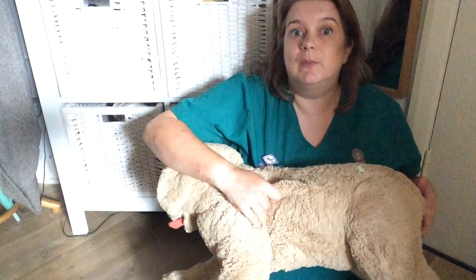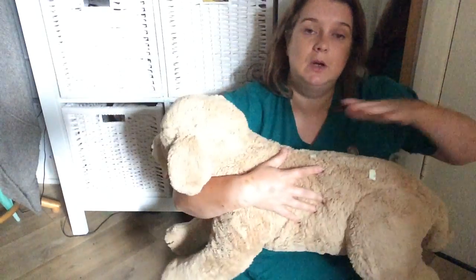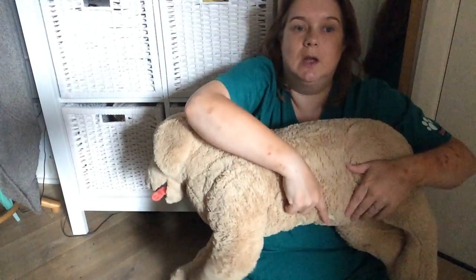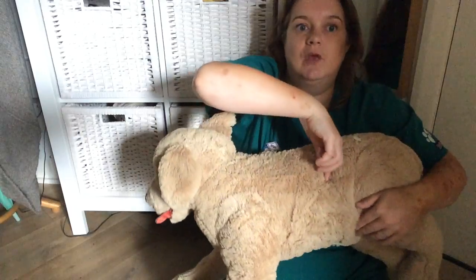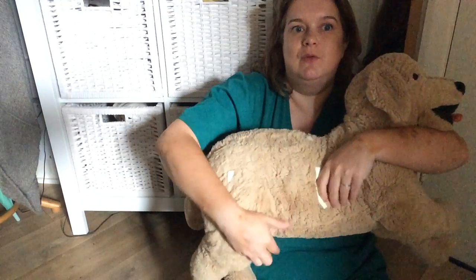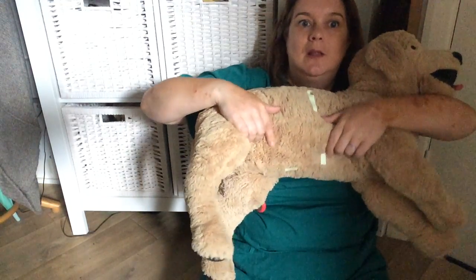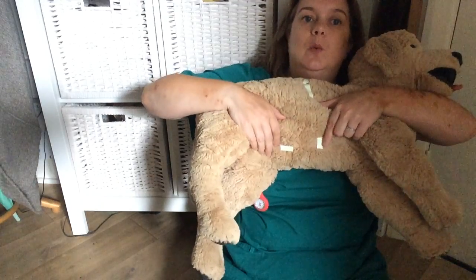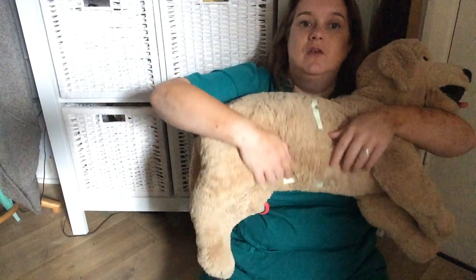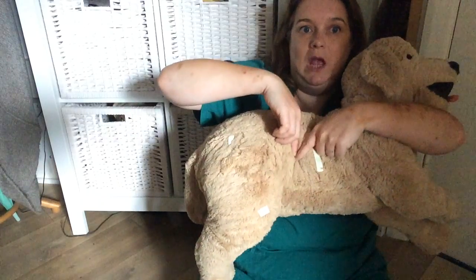Obviously in slightly fatter dogs you might have to feel for it. But essentially you've got skin surfaces — dorsal and ventral — then you've got a line coming up from the umbilicus here. So you're not doing the last rib. That's our last rib. This is where our xiphisternum is and this is where our umbilicus is, so we're going to put it here.